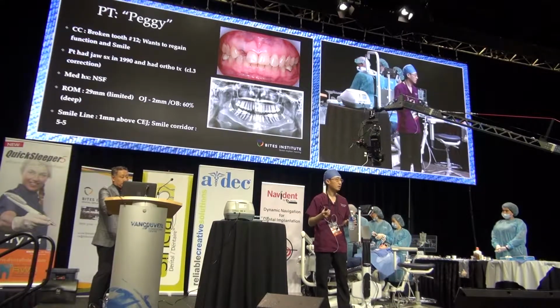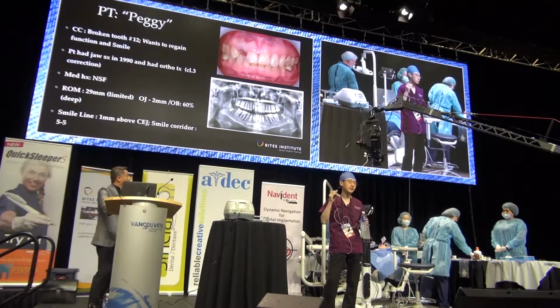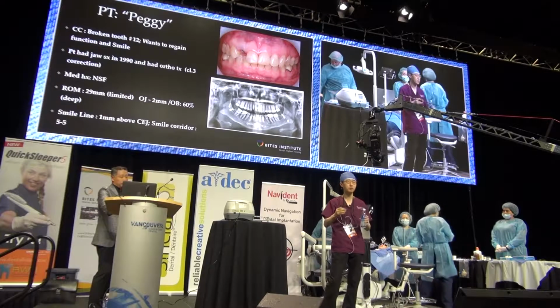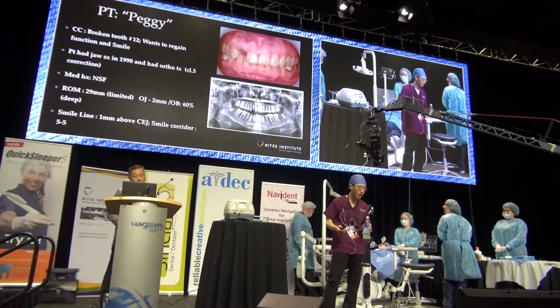Why is that? Because what we're trying to do is take the tooth out, place an implant today, and immediately temporize it. So we have to come up with a prosthetic solution to control that, which Dr. Lu will talk about later on.